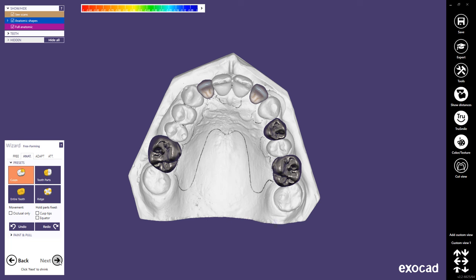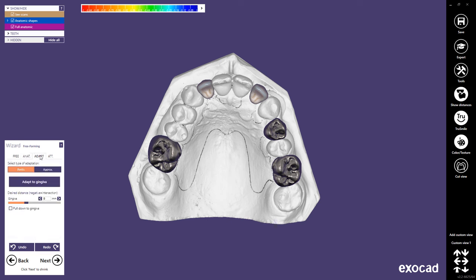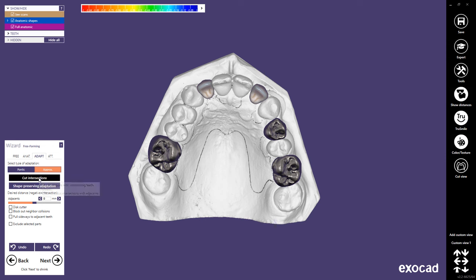In the freeforming step, you can freeform and adapt the restorations to the jaw scan. Freeforming will be shown in a separate tutorial. To adapt the lingual backings and metal dummies, select the Adapt tab. Here, click Adapt to Gingiva, then select Approximal and click Cut Intersections. Hit Next.